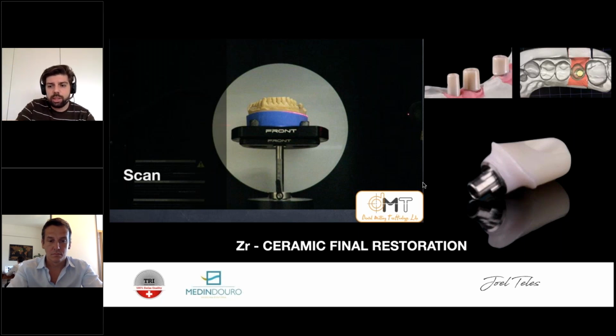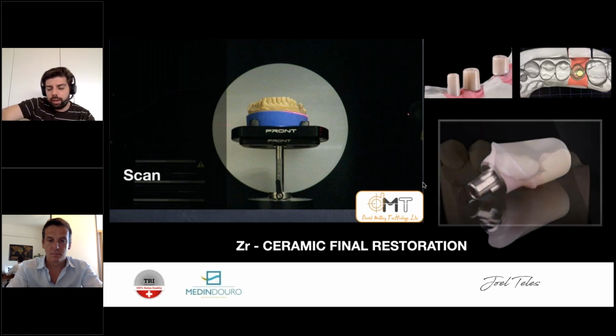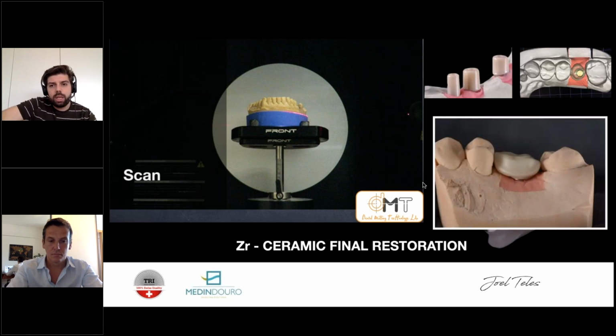So afterwards, you go through this, and one thing I thought about after the presentation: the frame of zirconia needs to be individualized. Up until the contact point, it's all the full frame of zirconia. The ceramic is only applied when it needs to be applied for aesthetic reasons. So the frame of zirconia is individualized for each case. It's not just a normal frame where you use ceramic all around. No, it's individualized for each case until the contact point.